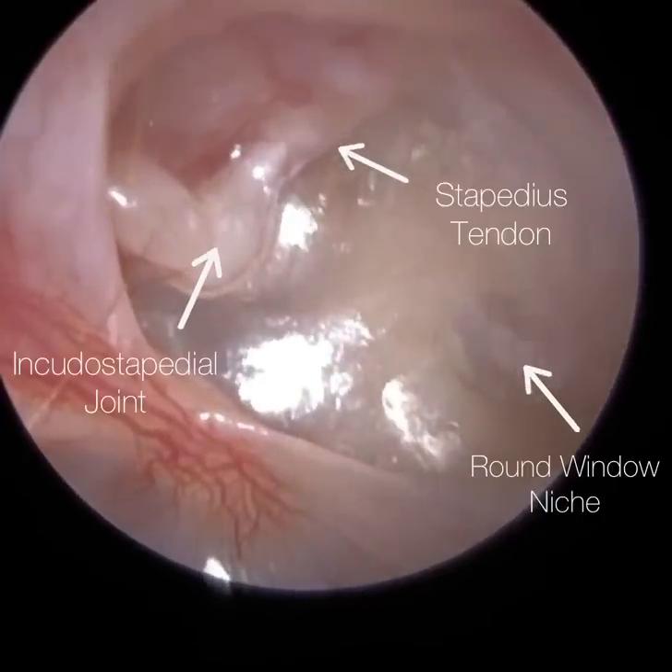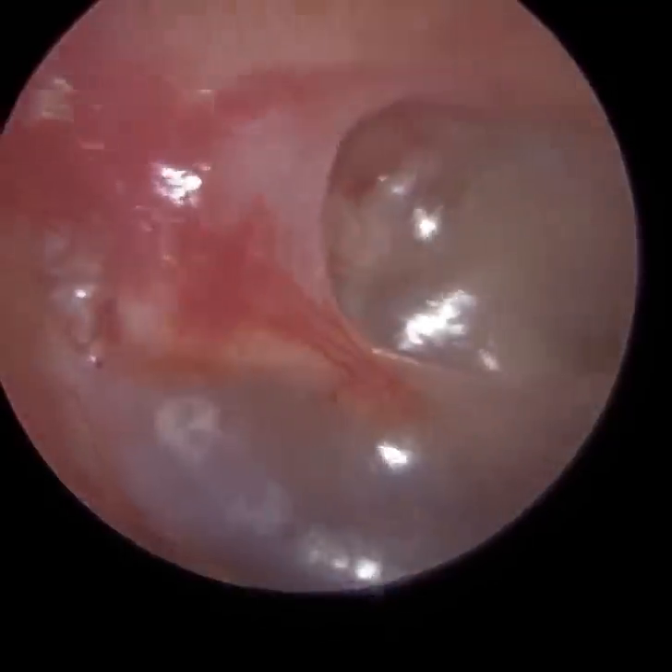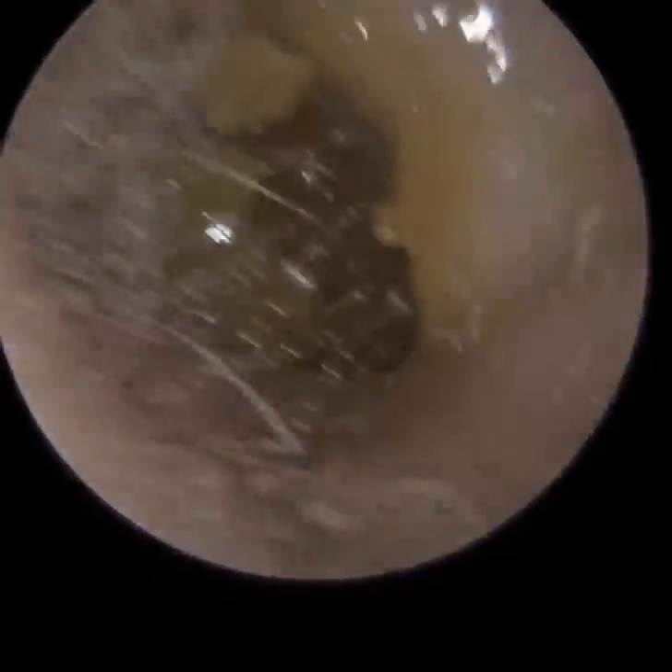I'm going to annotate some of the structures of the middle ear now. To the top right, we've got the stapedius tendon. Then to the left, we've got what we call the incostapedial joint — where the incus meets the stapes, the smallest bone in the body. Then you've got the tendon that connects to that. And to the bottom right, we've got what we call the round window niche. It's very rare that you can see that through an otoscope or endoscope if the eardrum is intact. So it was just a stunning view of the middle ear — looking right into the middle ear space. Hence why I had a bit of fun with the title of the video.